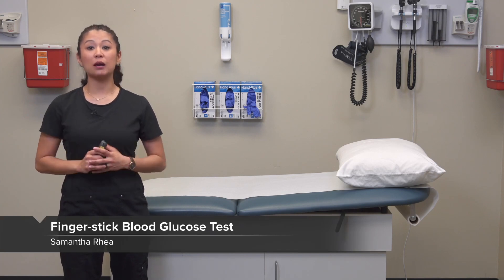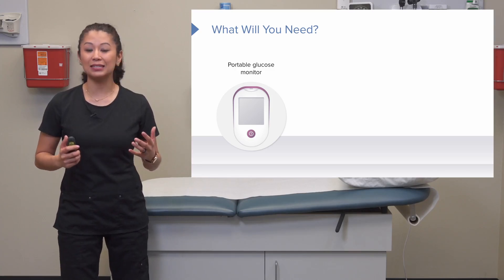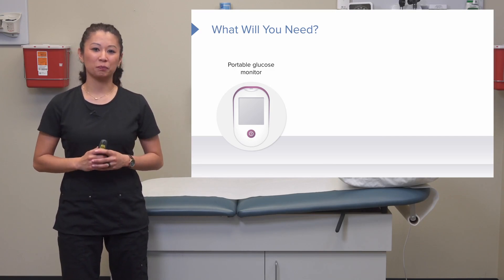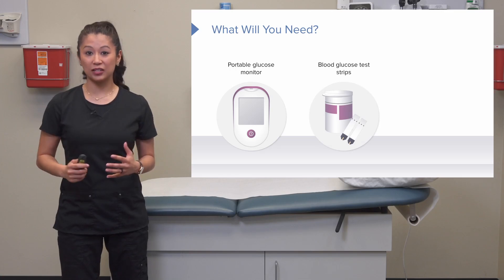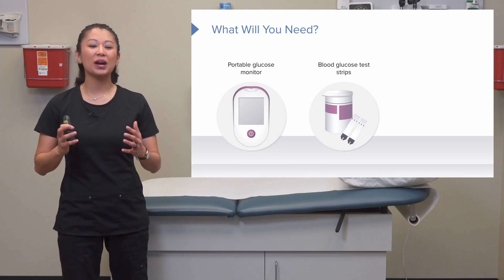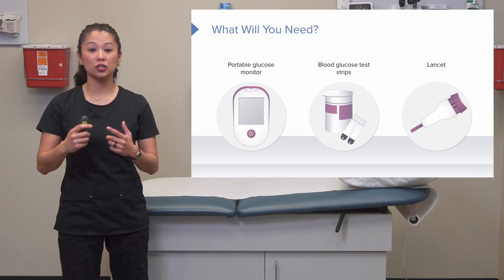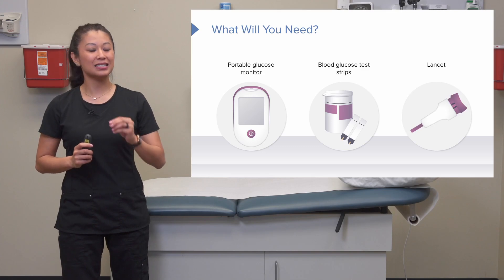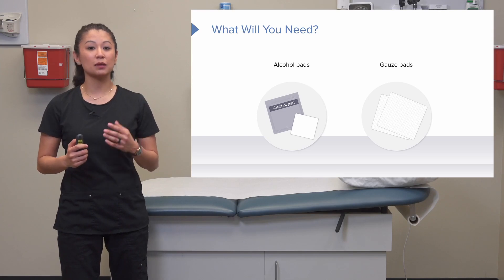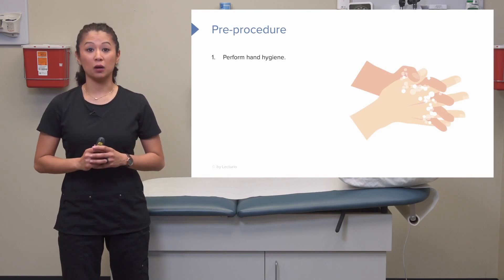Let's look at how we obtain a blood glucose. First is our portable glucose monitor, which will vary depending on whether you're in the hospital or at home. We'll also need blood glucose test strips — these must be compatible with your specific monitor. Next is the lancet, which provides the puncture to obtain blood. Lancets can vary from facility to facility. You'll also need an alcohol pad for cleaning and some gauze or a cotton ball.